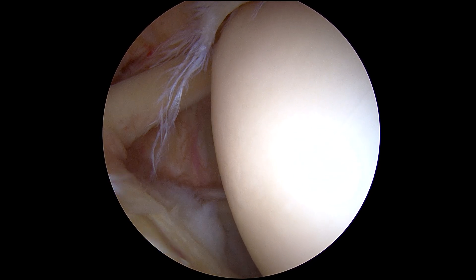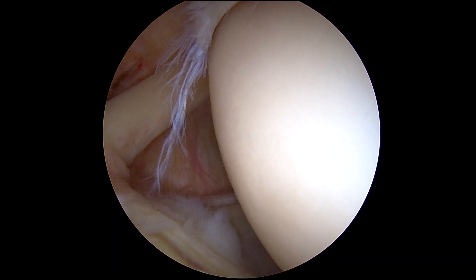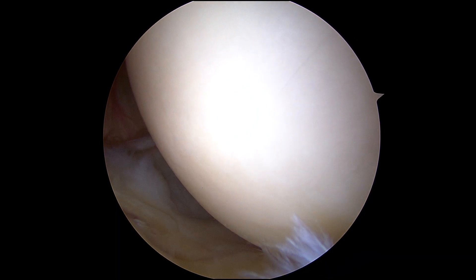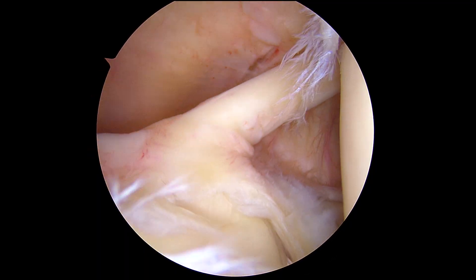We're in the right shoulder of a patient here. We're going to do a diagnostic arthroscopy showing you all of the major structures. First of all, that's the humeral head and then that's the glenoid in the front of the shoulder.